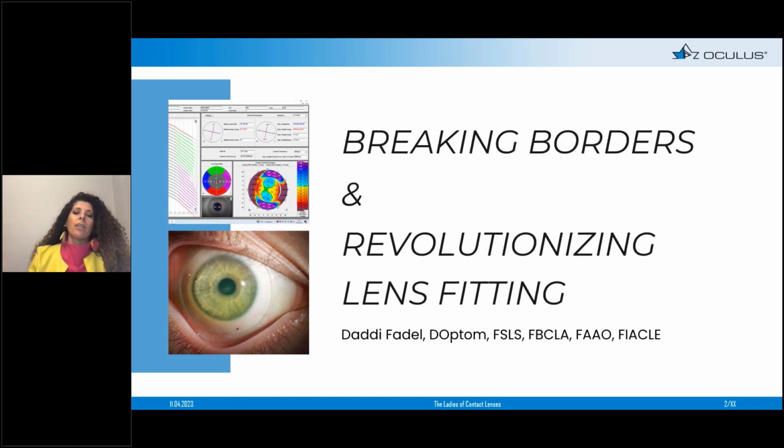Not only because of the lens design, the customization of the lens, but just because of the empathy, the education, and the compliance, they were improved. So today I will show how technology is breaking borders, connecting peers between continents, and helping patients all over the world to get highly customized contact lenses, specifically scleral lenses in this lecture.